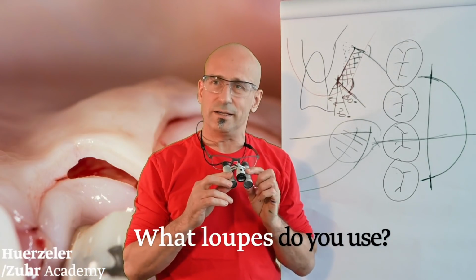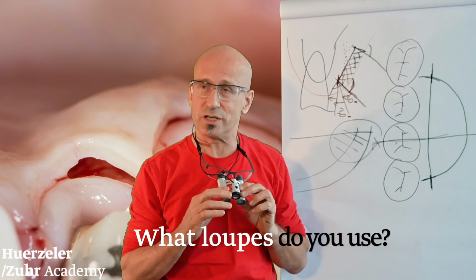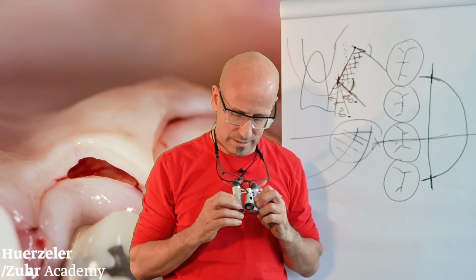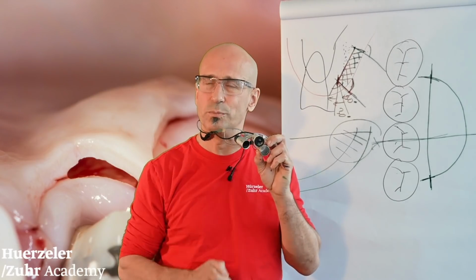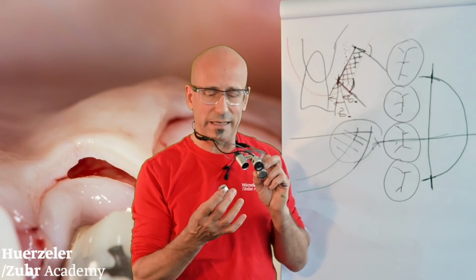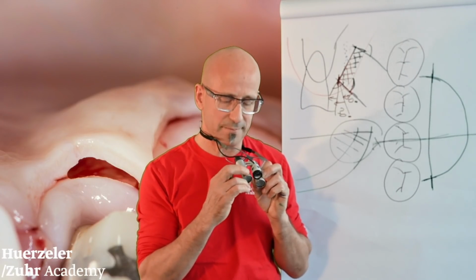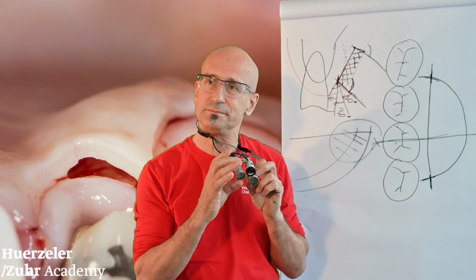Yes, this is the newest design we work on. Actually, we work with a 6 times magnification loupe with a 35 centimeter working distance, since this is our classical loupe, which we use. Everybody has light on it. And now we have developed a new tool with our partner from the industry, and we can add this on top now, as you see here.